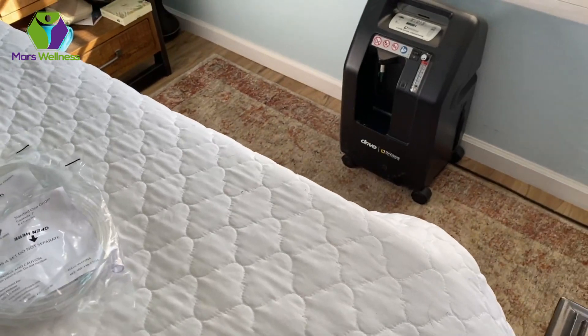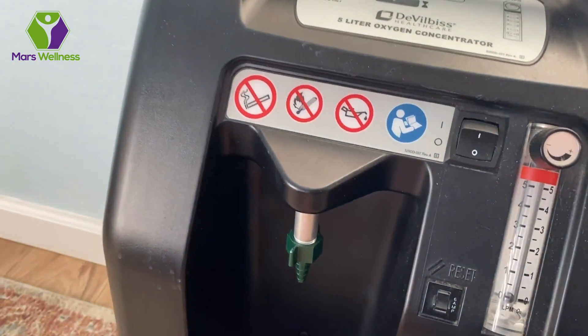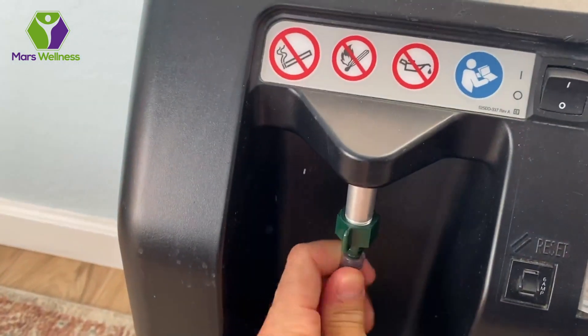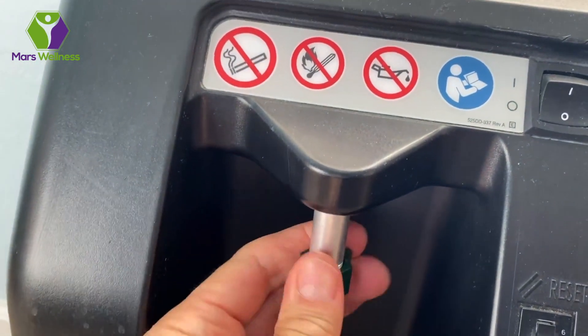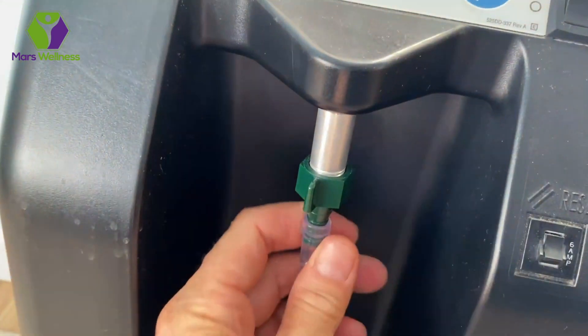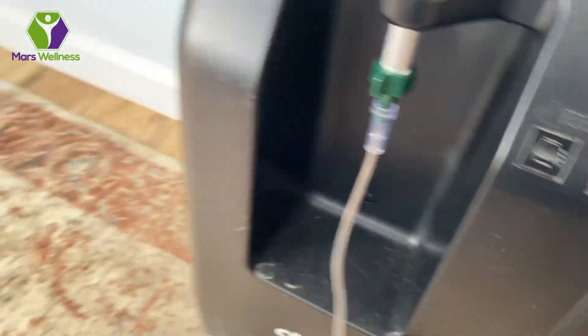Let me show you how I connect this. I take the tubing, come down to the concentrator, slip it on, push it in, twist it around, and it locks right in because it has that universal connection. Then I tighten this up and make sure it's good. Sometimes we actually have this connected into a little cup, which helps with the humidity. Then this comes out from there.